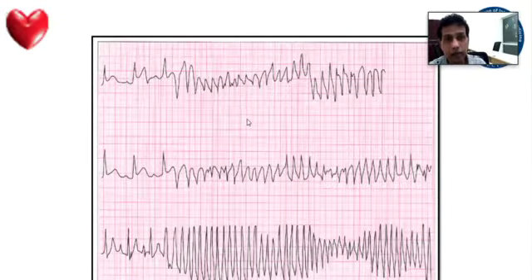That is why it is important to do cardiac monitoring in acute cardiac conditions. This person was having normal sinus rhythm, but with an ST elevation suddenly has gone into ventricular arrhythmia. So we have to act quickly and DC cardiovert this patient. If the patient has arrested, we are going to do a defibrillation.